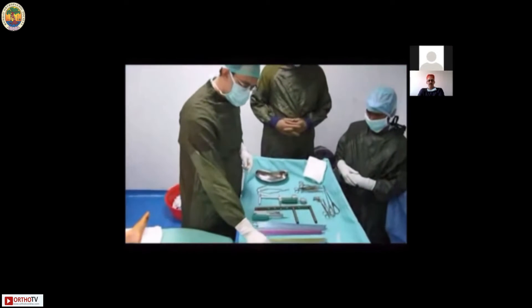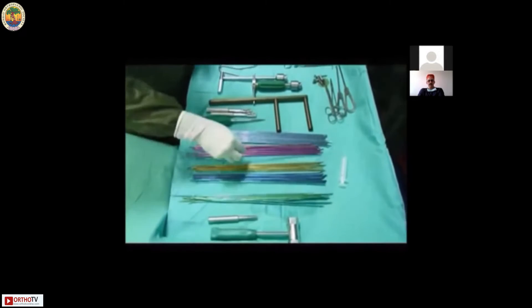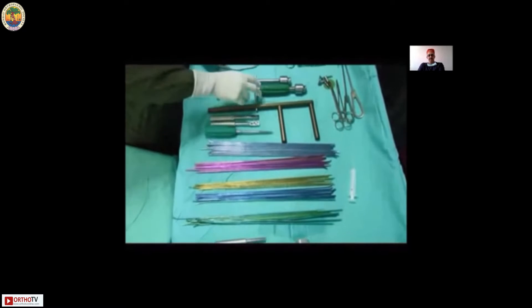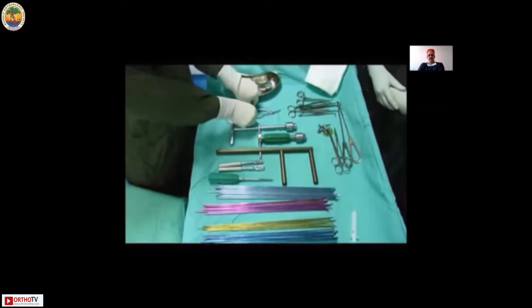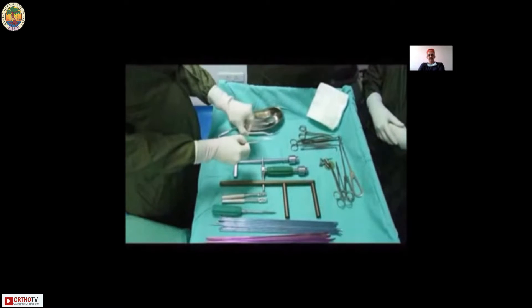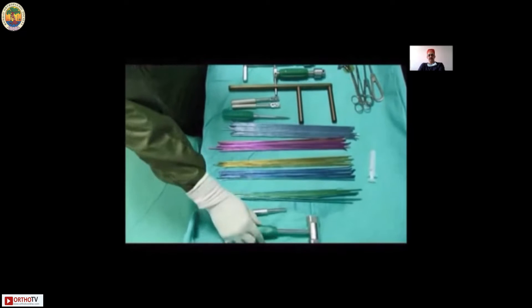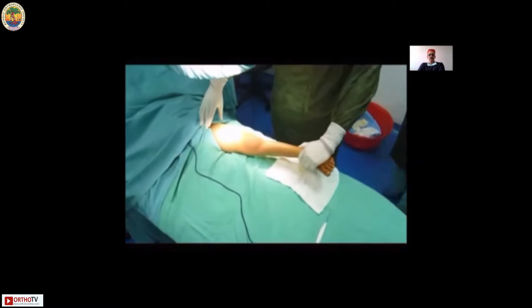Lay out your instruments on the trolley. The nails are color coded so that you can choose them immediately — the awls, the bending tools, the F tool, the chuck on the T-handle, the straight and curved awls, and a slotted hammer for insertion and extraction, and the seating tool.